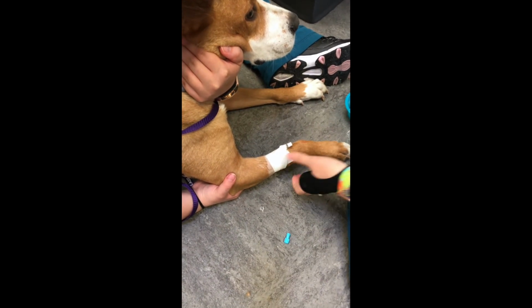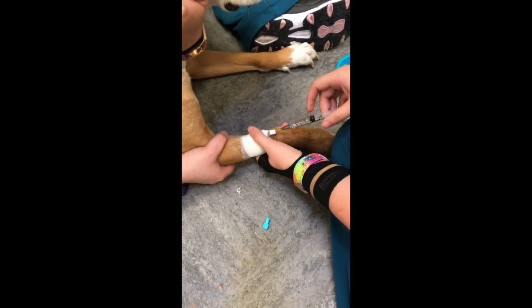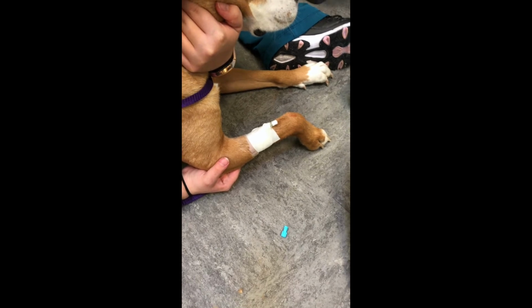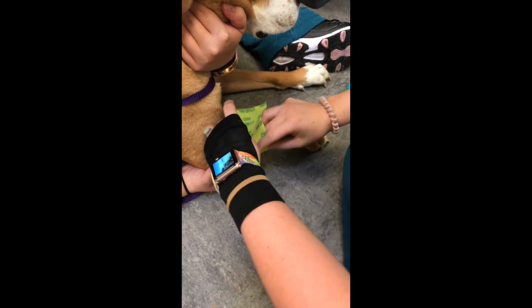Alright, and then with heparinized saline, we're going to go ahead and flush, just to make sure this is patent. Okay. Feels good. And then we'll put some no chew on here, and she'll be ready for her IV fluids.